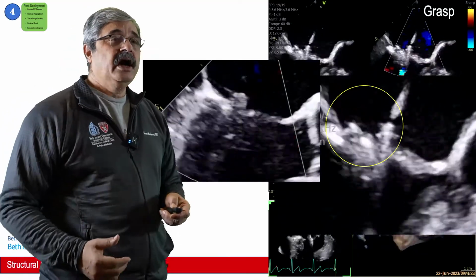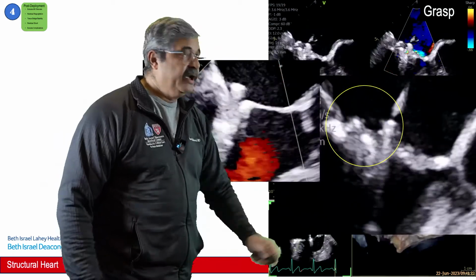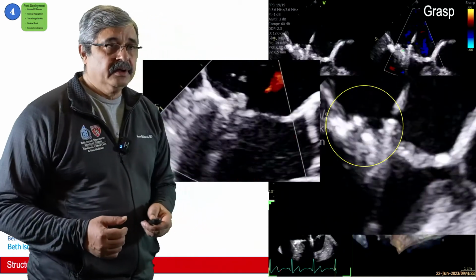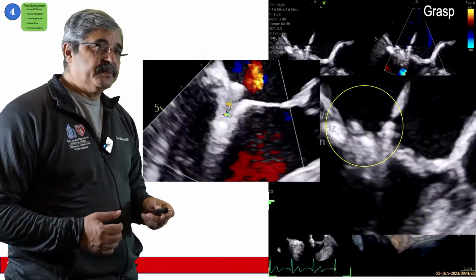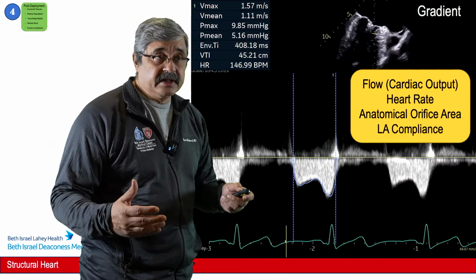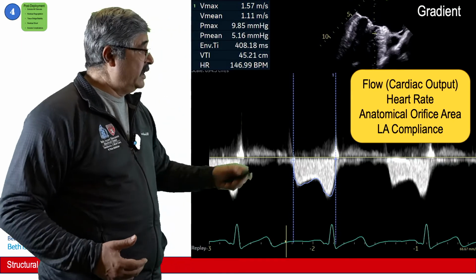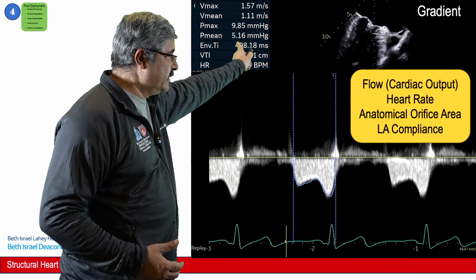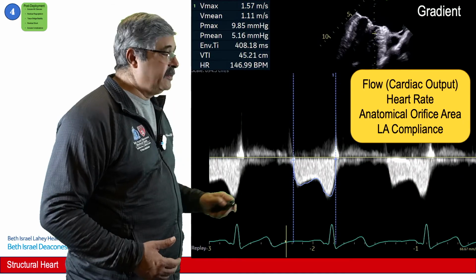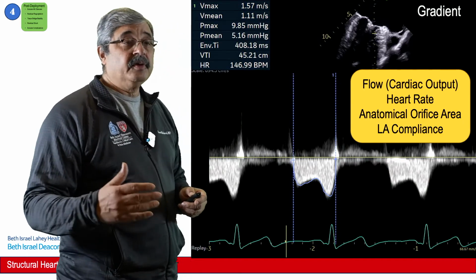It's checking on how well the grasp is, in the case which is highlighted on the right side. This one we had to optimize the grasp of the posterior leaflet. Now the most important part of the gradients, that's the second part of G, is to avoid stenosis. Sometimes you can end up having high gradients, like in this one, it is 5.16 mean millimeters. We don't follow the peak because the majority of it is flow driven, so we follow mean gradients.